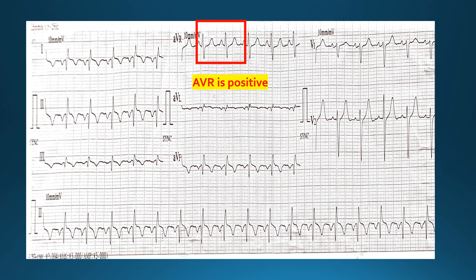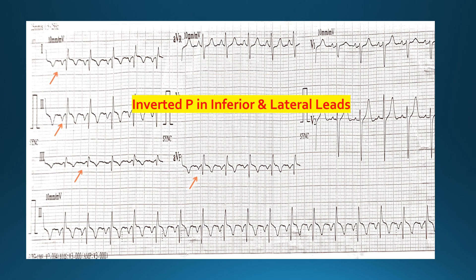First of all, the aVR lead is positive in this case. We can see that the P wave is positive, the T wave is positive, and the QRS complex is almost equiphasic. But in a normal sinus rhythm, all of these should be negative in aVR. So these findings being positive — does this mean something? Let's discuss some other findings before reaching a conclusion.